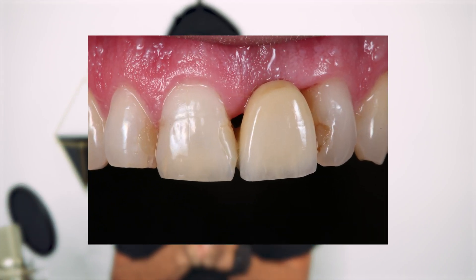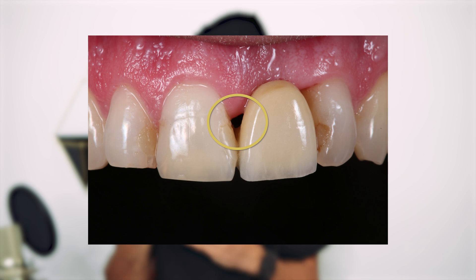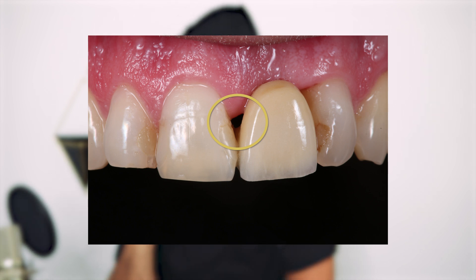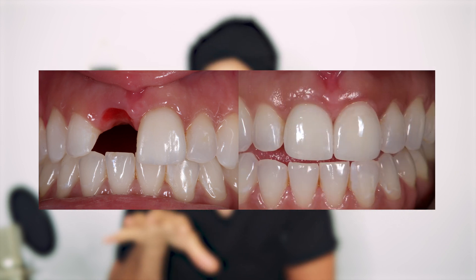We should be able to rebuild this black triangle that we've got and also increase the thickness of the gum so that we get a nice aesthetic appearance to the temporary tooth. Whenever we do any cosmetic work like this, we always want to get it right in the temporaries. Once the temporaries look really good, then it's easy — we just make a crown, fit the crown, and it works every single time. That's how we got a good result in this case.